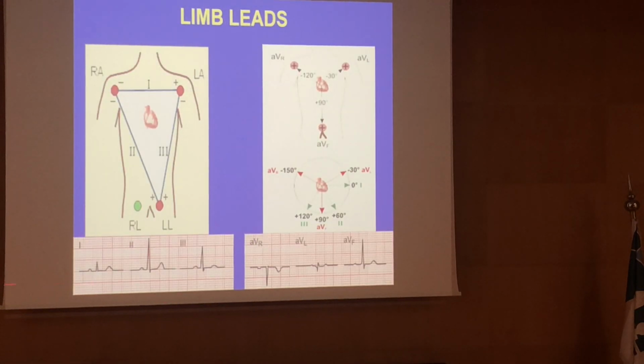Now let's look at what we expect the signal to be. So lead 1, we mentioned P wave positive, QRS complex positive, T wave is positive. Lead 2, the same, lead 3 is the same. Why is lead 2 a taller R wave than lead 3? Yeah, the wave of depolarization goes more towards lead 2. It goes this way, more towards lead 2 than lead 3. So we have it more positive in lead 2. Right? This is the basic principle.